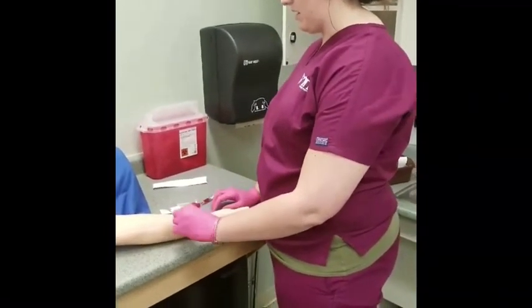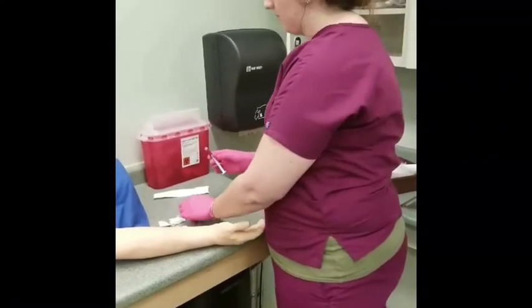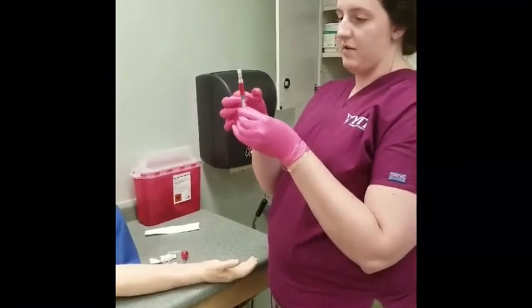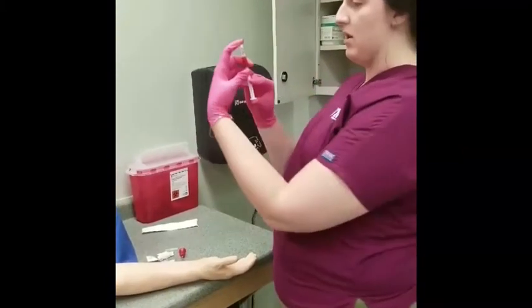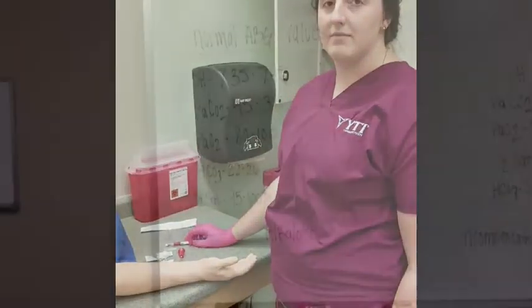And then after you do that, you're going to take the needle out, put the other cap on, flick to make sure you have all the air bubbles out, push it up, and send it down with your sample bags.